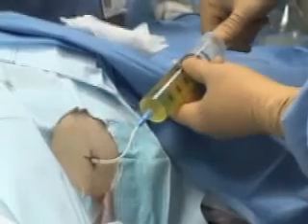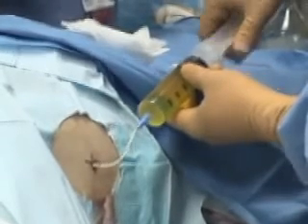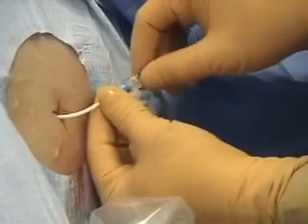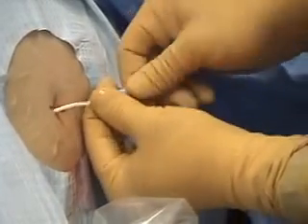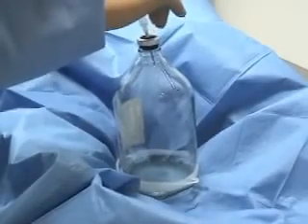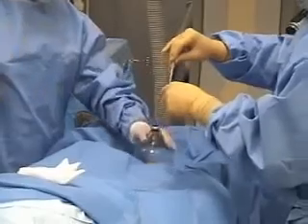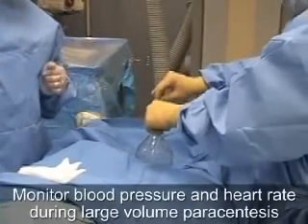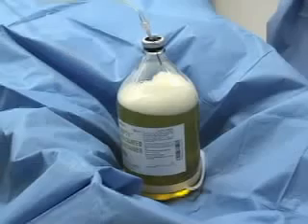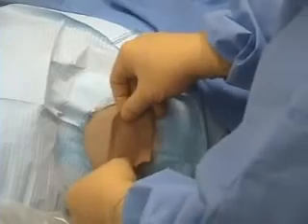If a diagnostic sample is required, attach a large syringe to the catheter and aspirate 30 to 60 milliliters of fluid for analysis. For therapeutic large volume paracentesis, attach the high pressure tubing to the end of the catheter and then to an evacuated container. Further containers may be used for collection of fluid if necessary. Blood pressure and heart rate should be monitored during large volume paracentesis. Once the desired quantity of fluid has been removed, withdraw the catheter and apply a bandage.